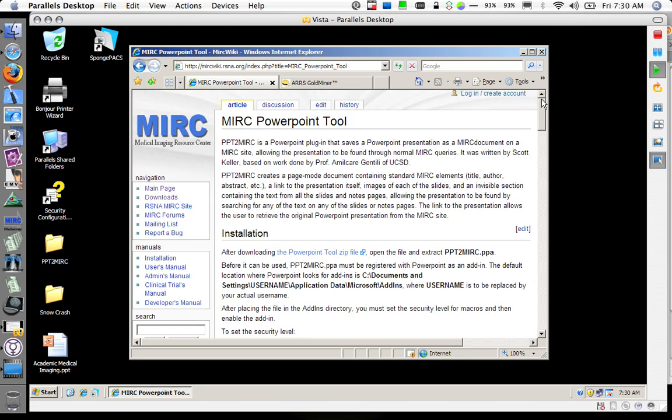One thing I want to show on the screencast is how quick it is to get existing PowerPoint presentations you have up onto a MIRC site, searchable and in MIRC format.